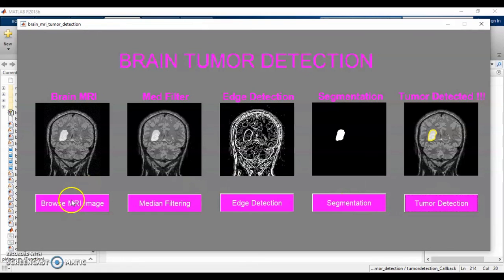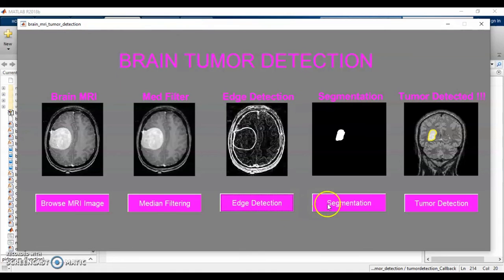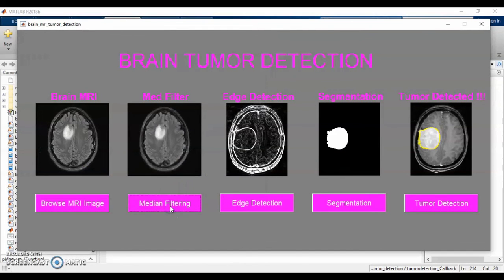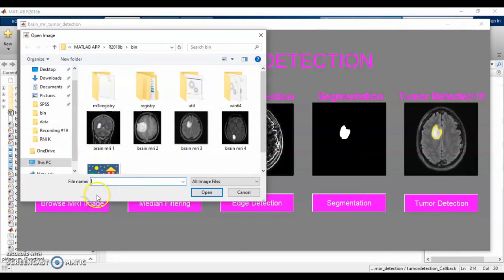So now, let's try with a few other images. This is the second image. Alright. Let's try with the third image. Let's browse for the fourth image.